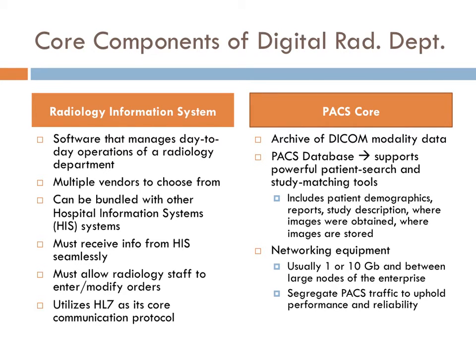There are different parts to a PACS. It archives the DICOM modality data. The PACS database actually supports the powerful patient search and study matching tools. So this could include patient demographics, reports, study description, where images were obtained, like on different modalities, and where images are actually stored.